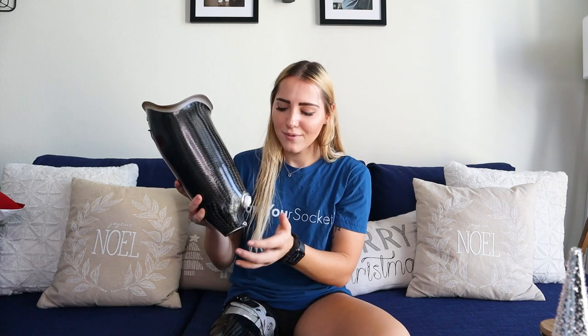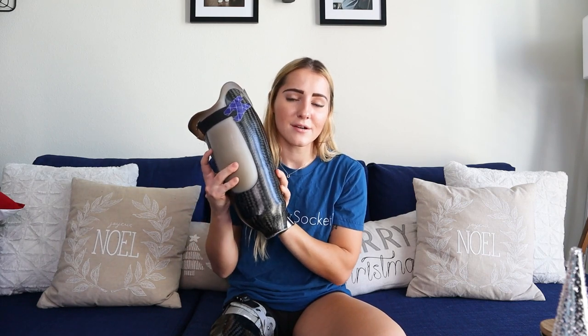Not that these aren't great and don't get the job done. However, there are a lot of problems with traditional sockets. One of the main problems is that it's just all carbon fiber, and besides this little cutout, there's literally nowhere for your stump to go. It's just stuck in this.